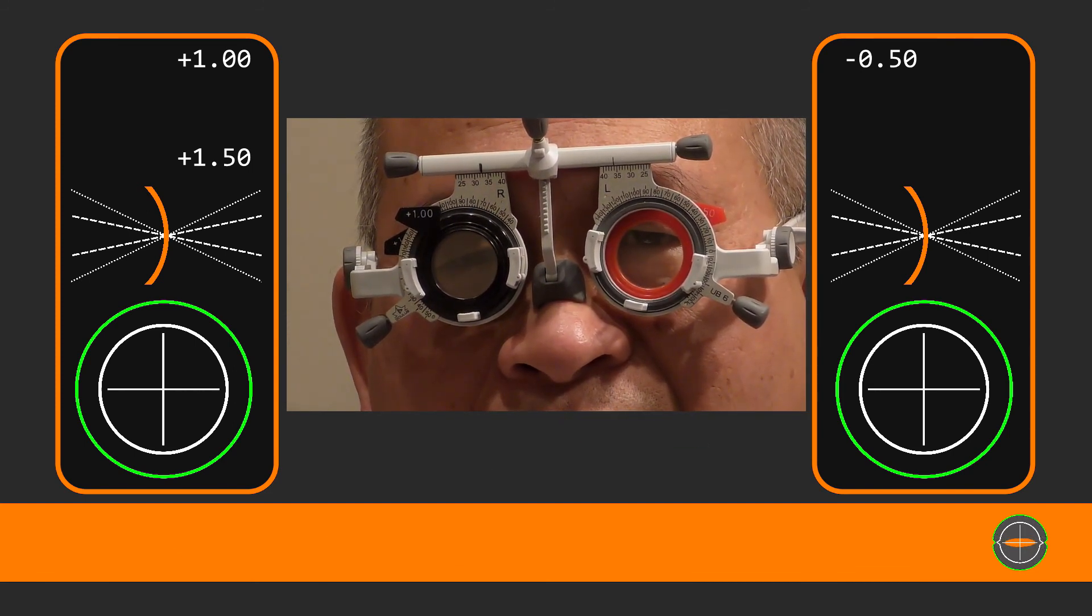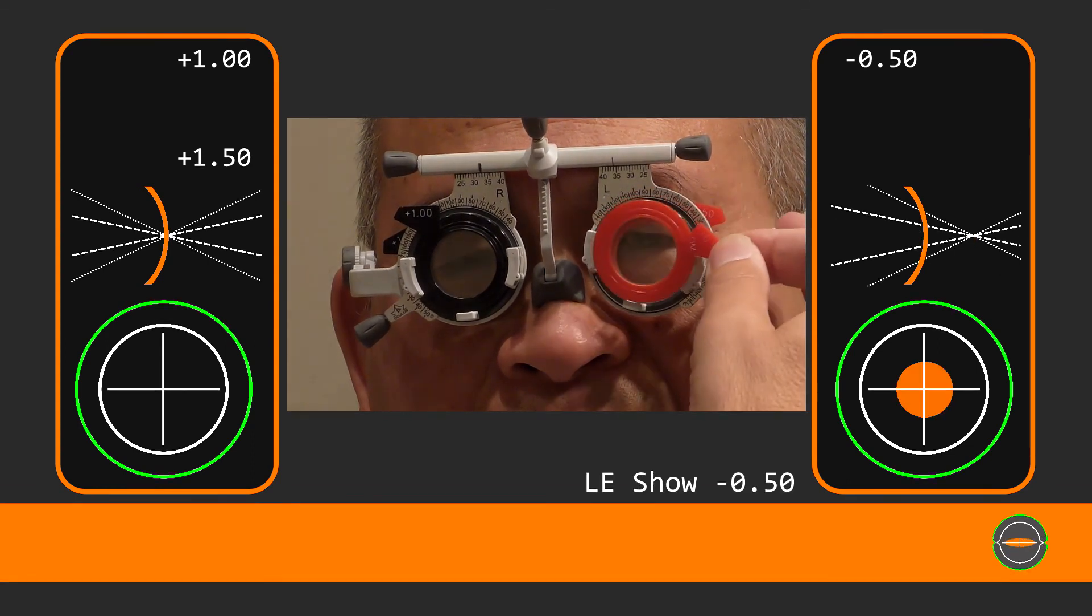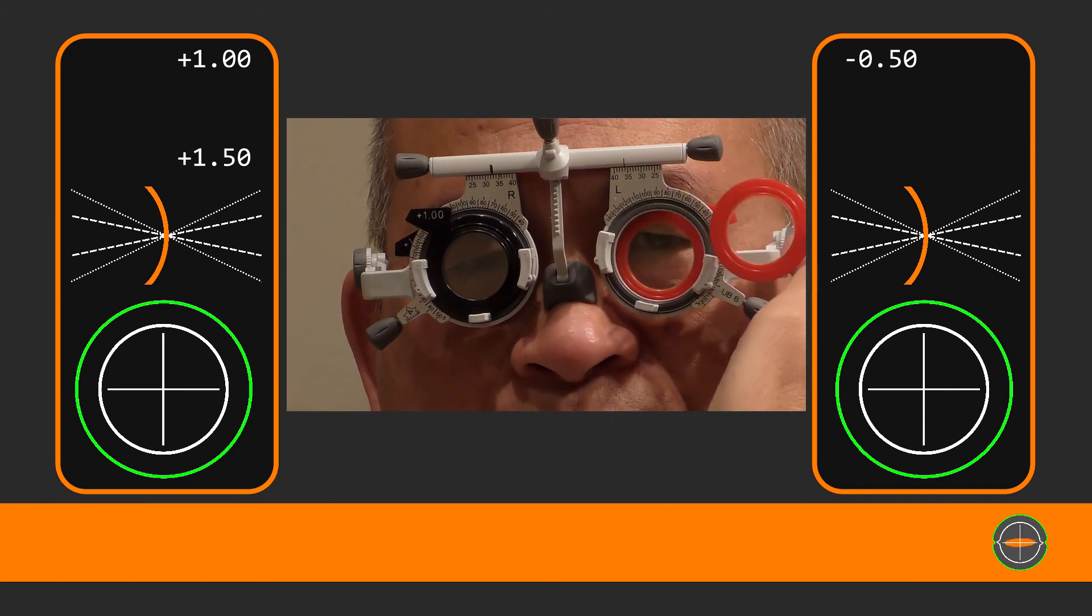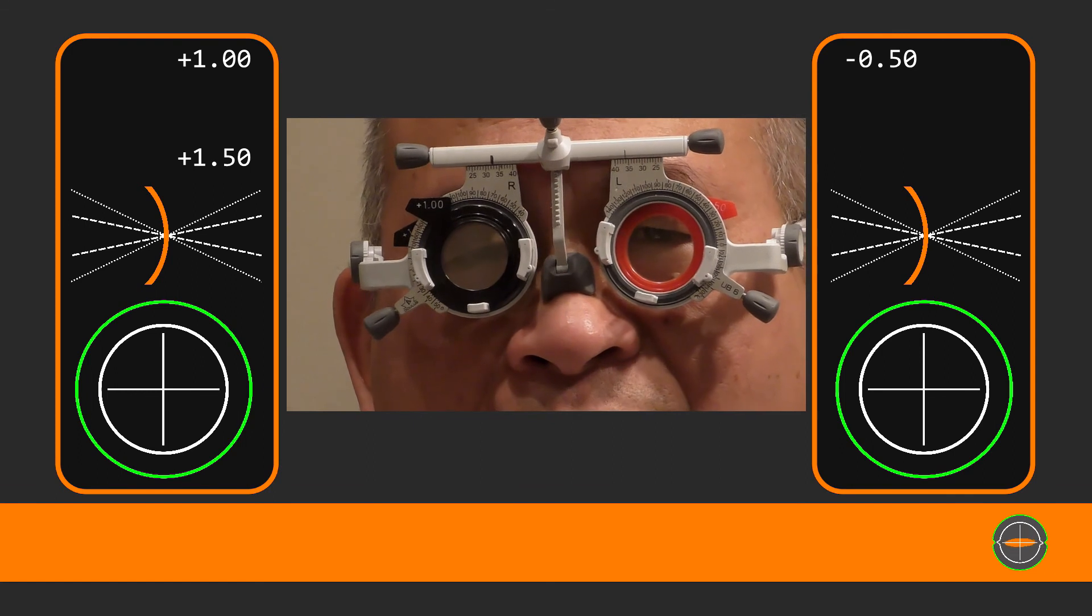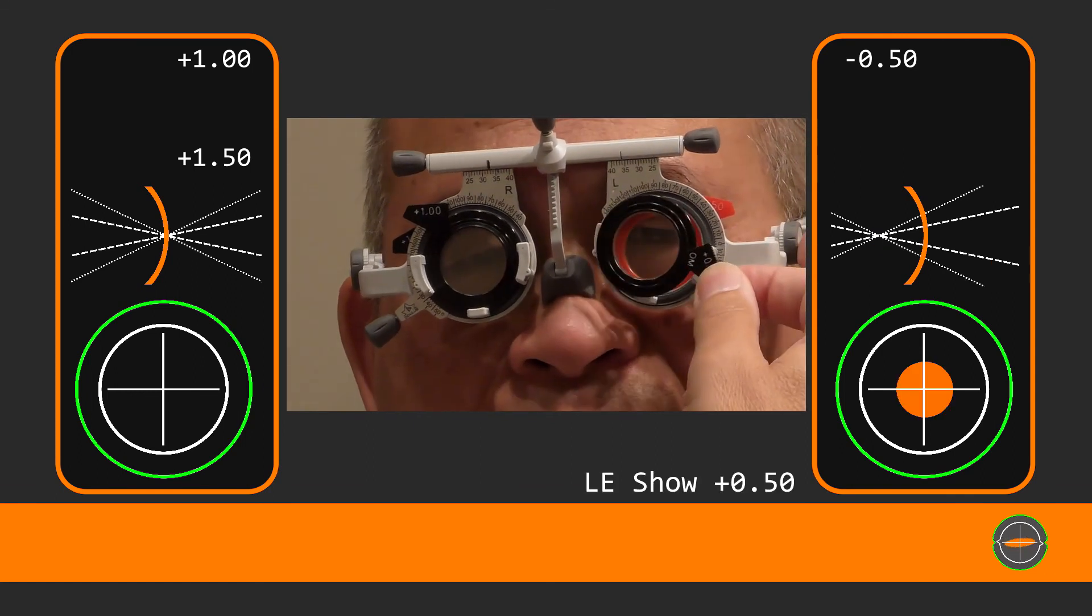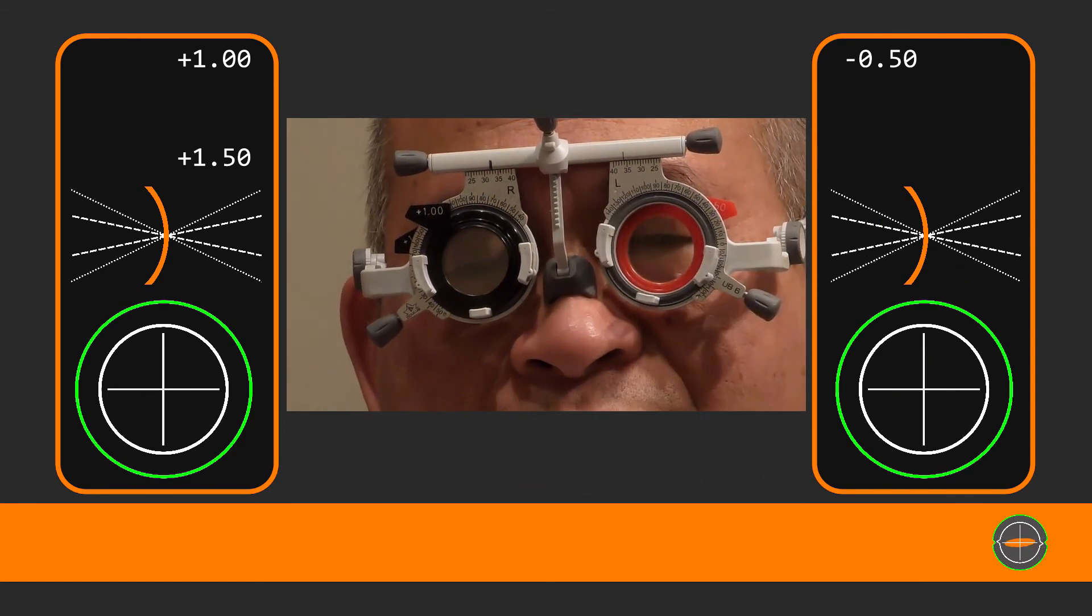Let's continue with the refraction. Better with that one or without. Better without. And again. Better with that one or without. Oh great. Alright.